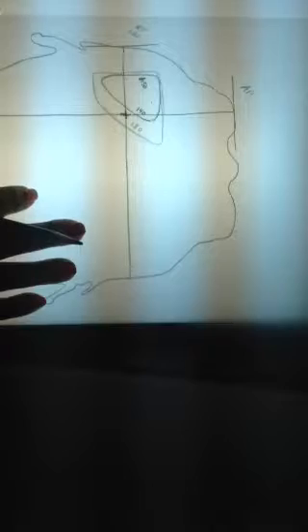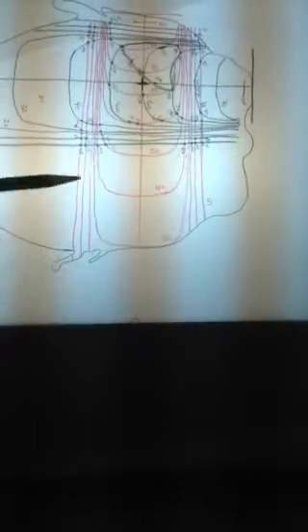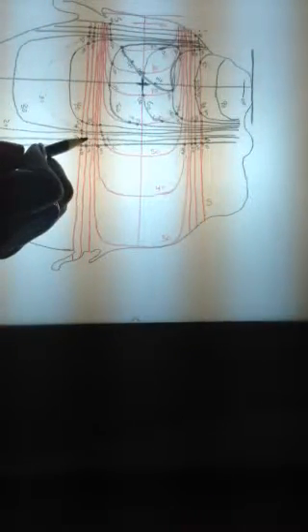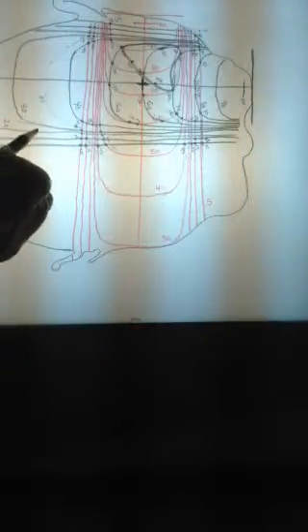Now I would like for you to complete this out until the lowest cumulative isodose are represented on this page. So I want to see all of the dose points here, all of the dose points across the tissue. So that means you're going to have to work with the lower dose point areas as well. There's 45, for example. There's 20, there's 15. Do the 15s connect? Is there another 20 across this way that maybe connects?